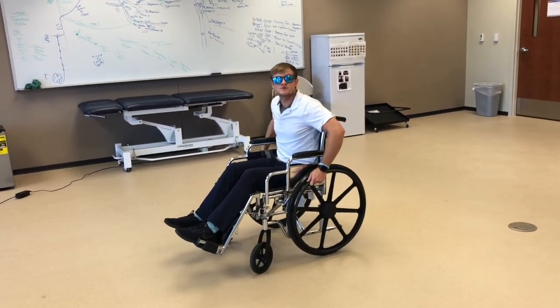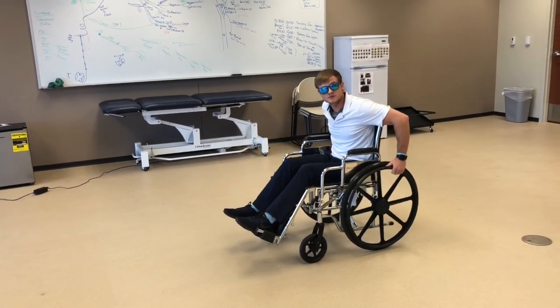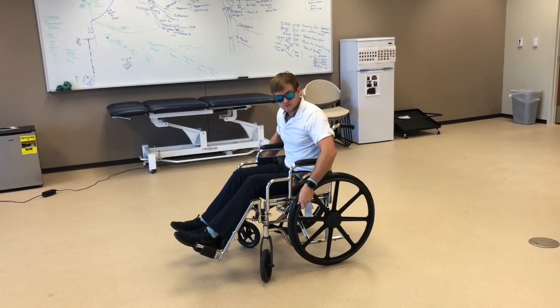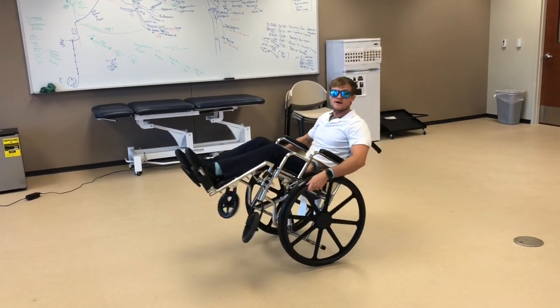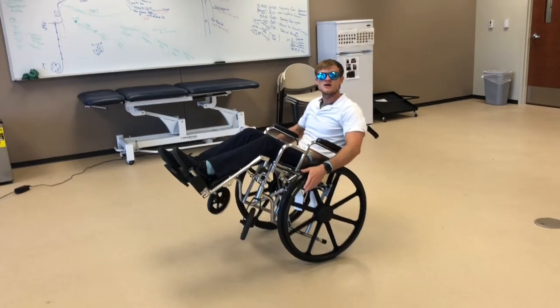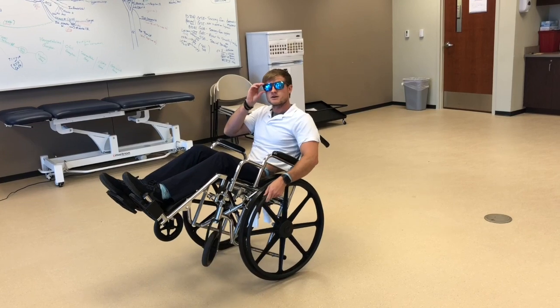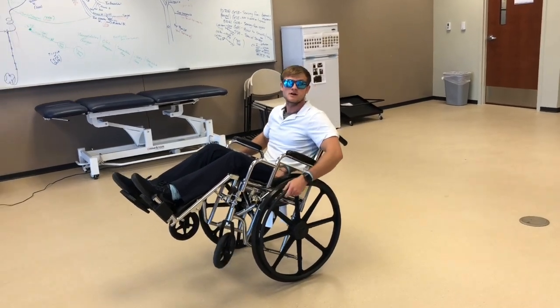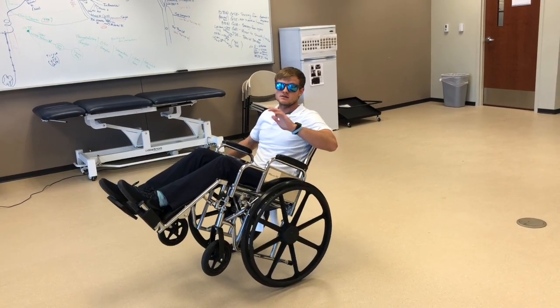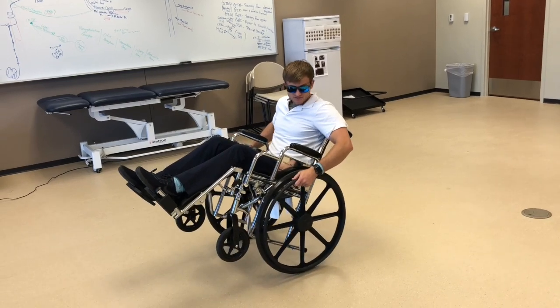The other thing we can go over is doing a wheelie. To do a wheelie, you're going to have your momentum go backwards, then go forwards, and that's what props you up into the wheelie. You start at 2, go to 10, and then go right back to 2, and that props you up. To maintain the wheelie, it's all about balance. When it's your first time, you want to make sure you have a spotter there because you don't want to fall. For some wheelchairs, you can also install anti-tippers — wheels that prevent you from tipping all the way over.